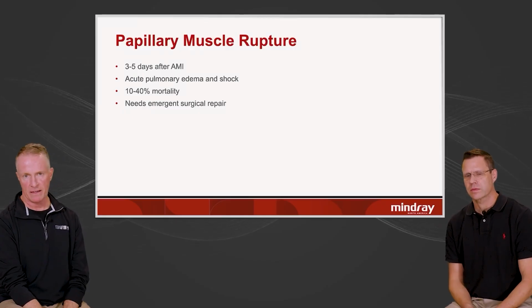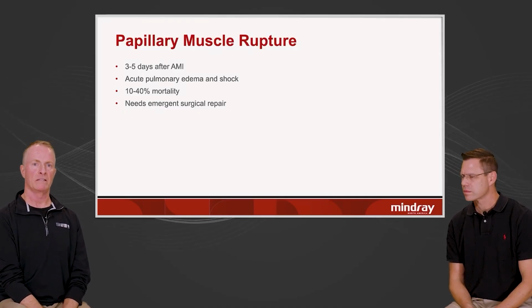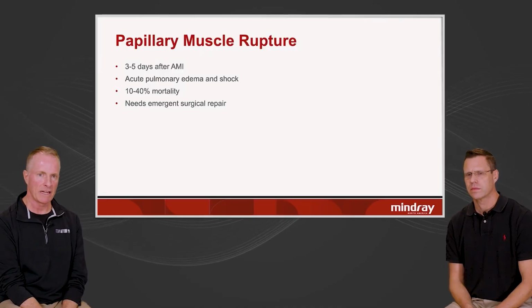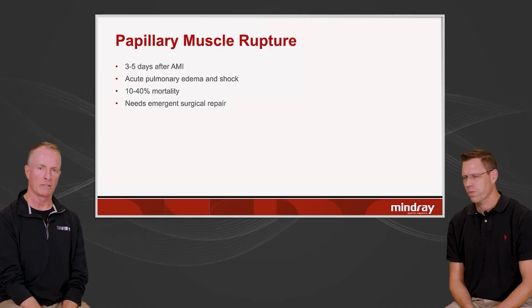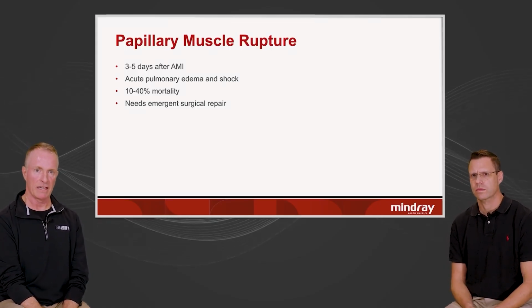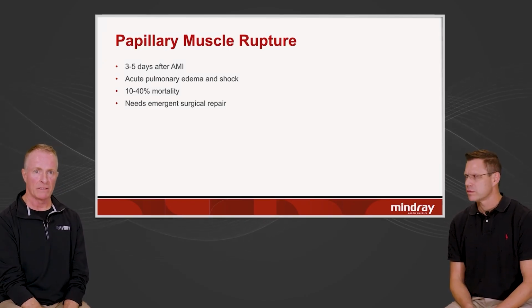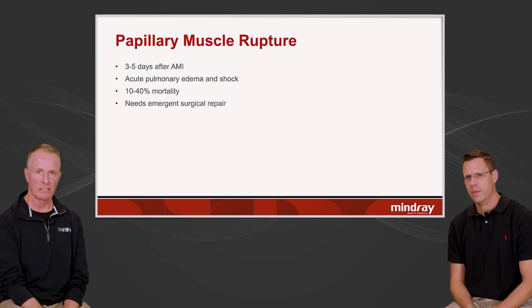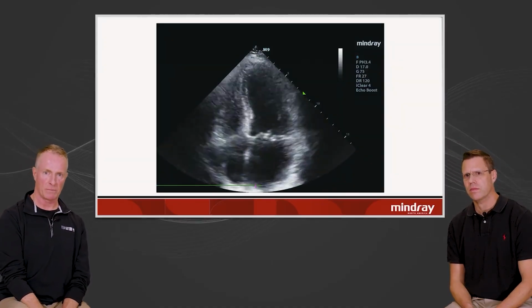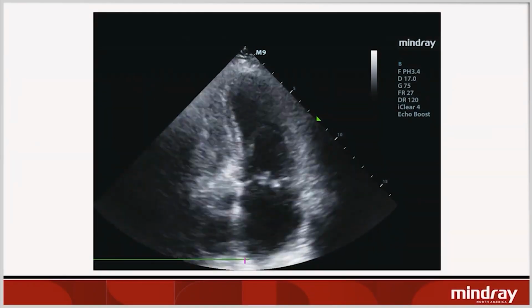Yeah, and you need to think about putting color across, behind the mitral valve, but just realize that when they're extremely tachycardic, it might be hard to interpret. So you need to look closely, slowing the image down, freezing it, slowing it down, and actually looking at what the valve leaflets are doing. This is an example of someone who's not that terribly tachycardic, but has a partial papillary muscle rupture.